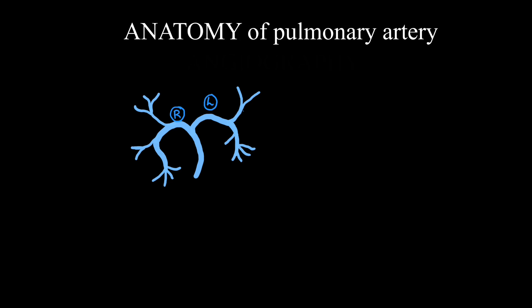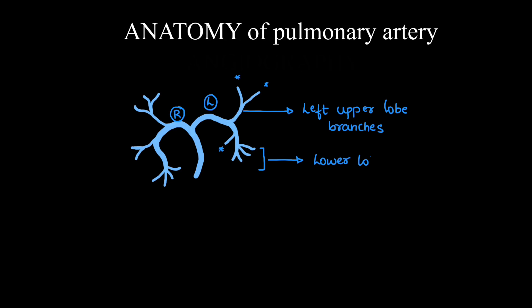The left main pulmonary artery has upper lobe branches for the anterior, apico-posterior, and lingular segments, as well as the lower lobe branches. Similarly, the right main pulmonary artery has branches for the upper lobe — anterior, posterior, and apical segments.